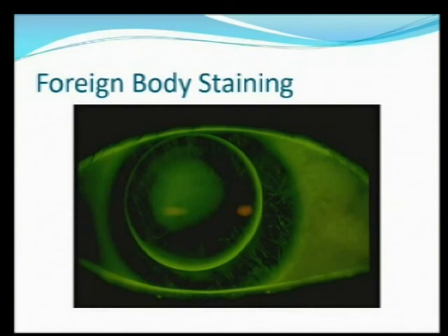If the patient has been out in a dry, dusty environment and there's things flying around, they may come in, you put fluorescein, and all of a sudden you see these wild, swirly patterns on the cornea. These are extremely superficial, caused by dust particles. If you put fluorescein in this patient, in probably a half hour, those would be gone. But it does point out why anybody that gets contact lenses should also have a pair of sunglasses to wear outside, particularly on windy days.